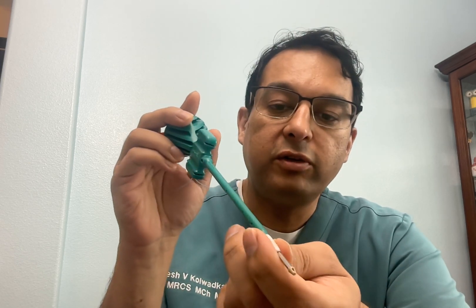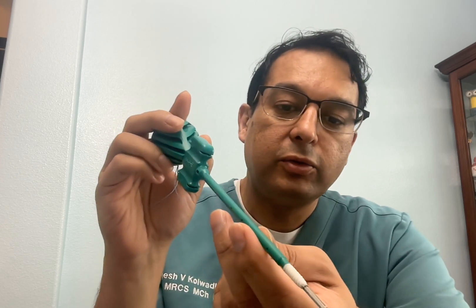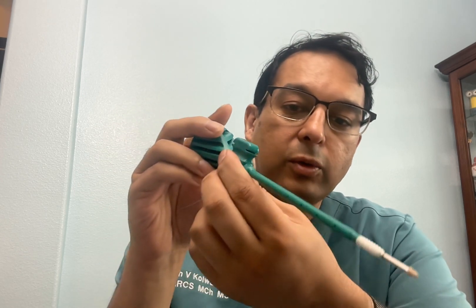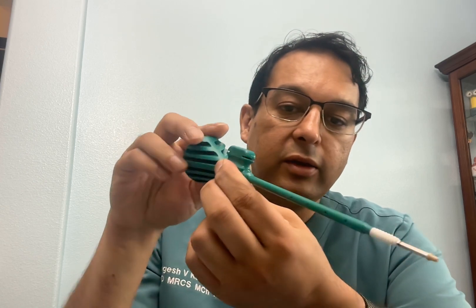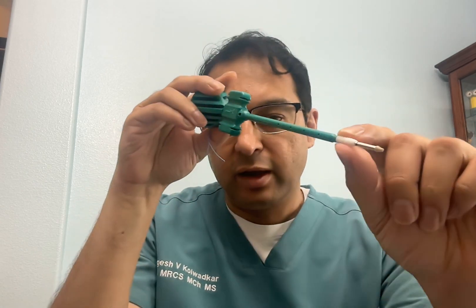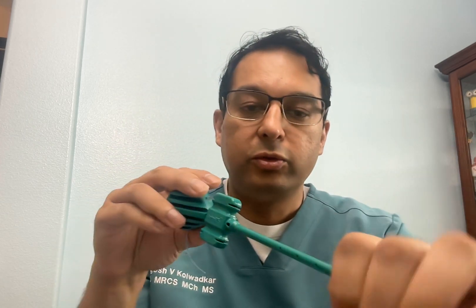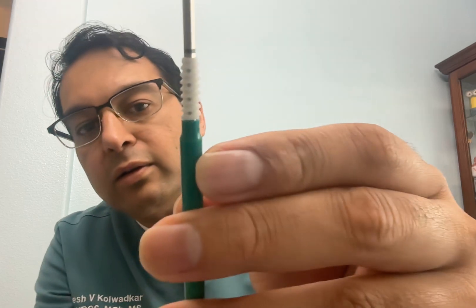The hole is punched — we don't use a drill — so that it can compact the bone. This anchor then goes into the bone. You hold onto the square and turn the pear-shaped handle, which advances the anchor into the bone and holds the suture, fixing the tendon to the bone.